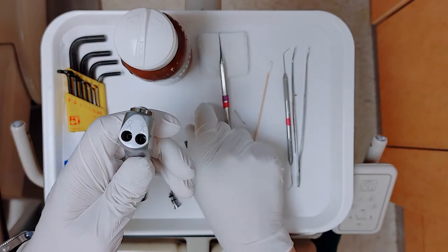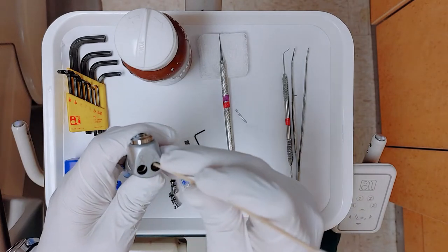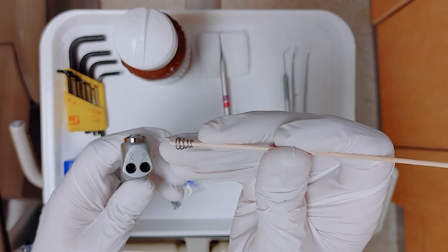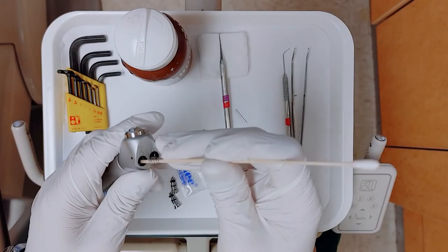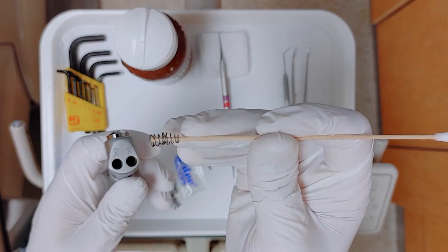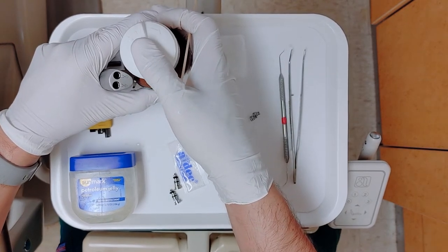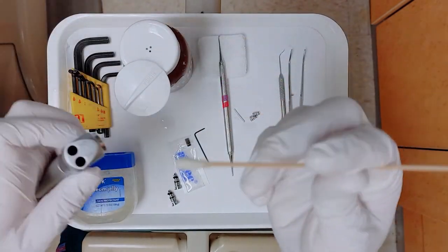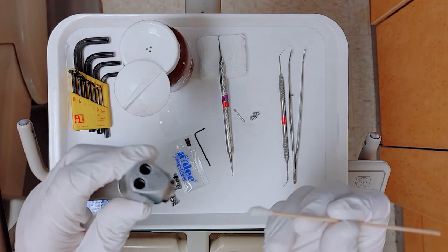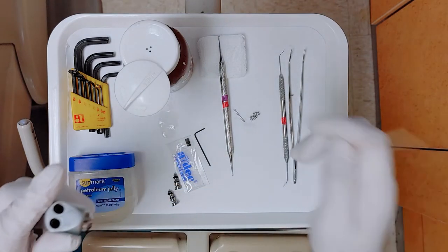Like I mentioned, inside one of these little pieces there's going to be a spring. So I have this little cotton tip applicator that I can use to gather these little springs. These springs can get gunked up with a lot of crud and everything also, so just be mindful that it's probably a good practice to clean these out also. So what I'm going to use is this alcohol bottle, give it a couple pushes, get some alcohol so I can clean out the interiors of my air water buttons. There might be some gunk left over behind, and this is a clean one at the moment, so there's not too much of a problem here.